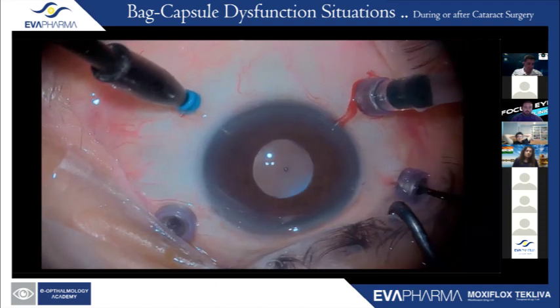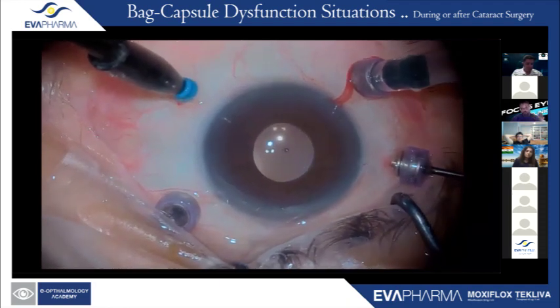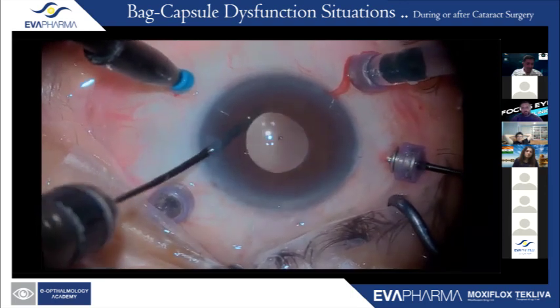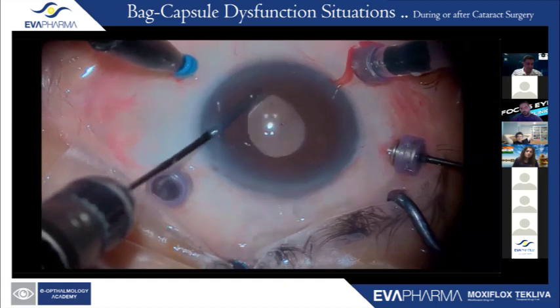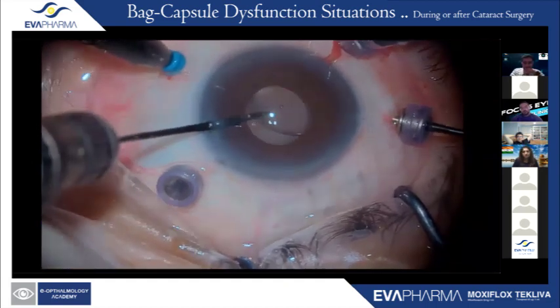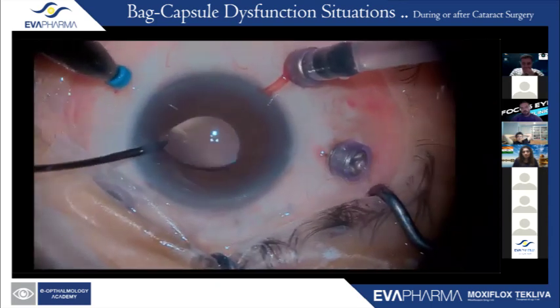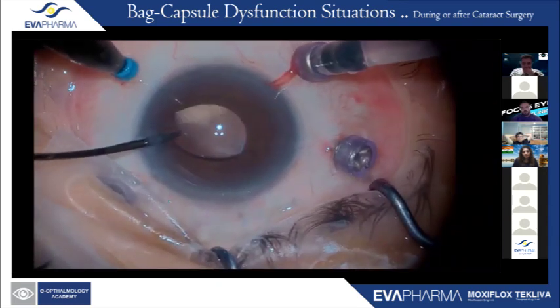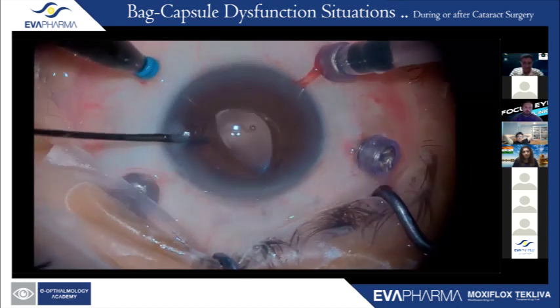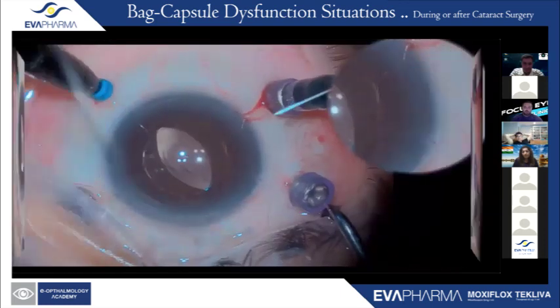Now, when I lift the lens with my crocodile forceps, I will use a micro grasper from the anterior chamber to reposition the lens over the iris and in a position which will be convenient for me for iris suturing. So the 3-piece lens is really comfortable for that.